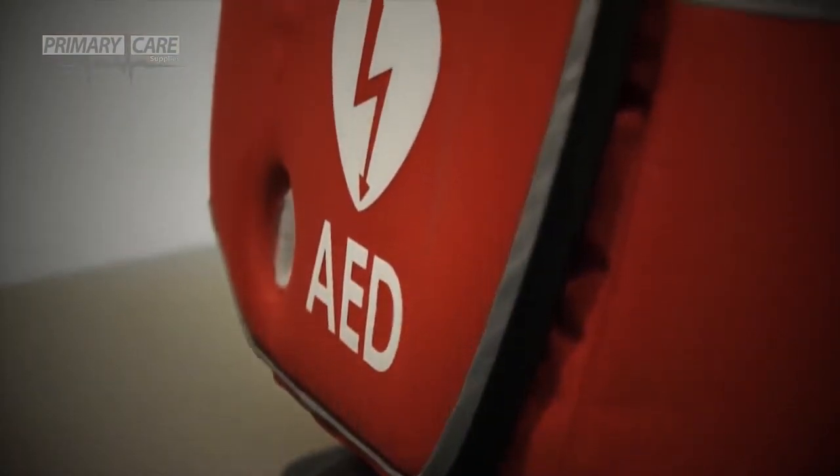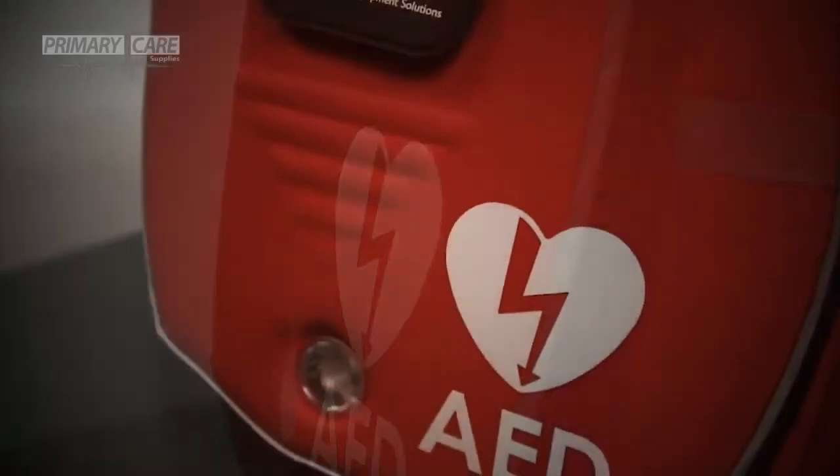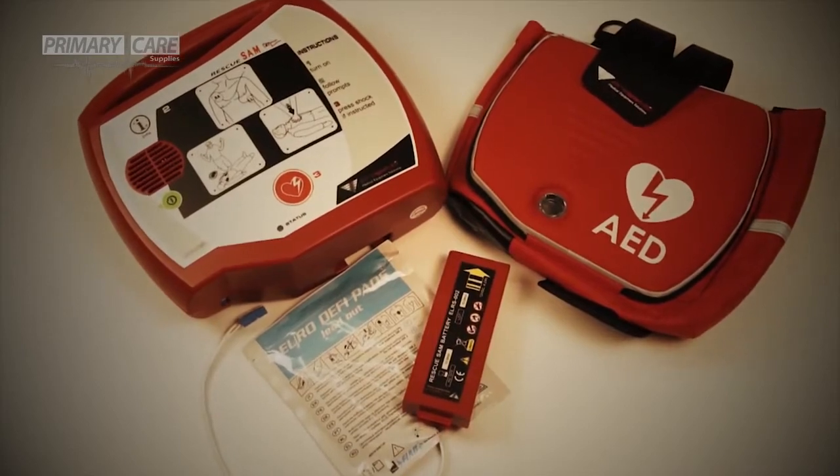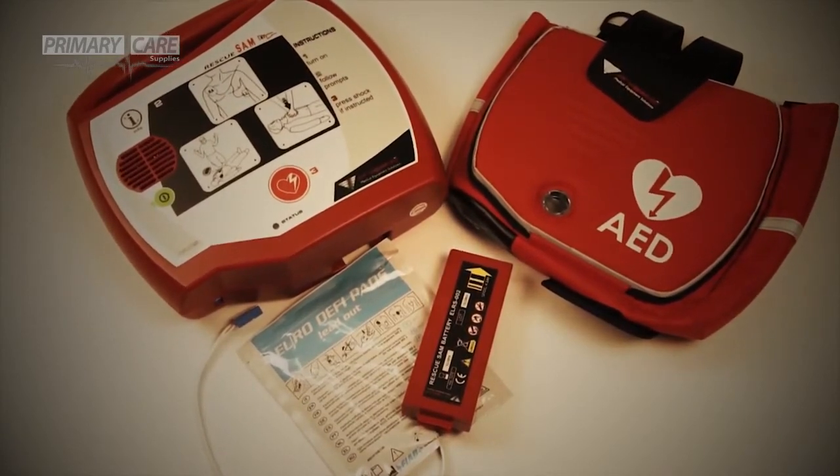Hello and welcome to this short video demonstration on the Rescue Sam Semi-Automatic Defibrillator. The Rescue Sam Defibrillator is really simple to use and comes with a protective bag, long life battery and a set of ready-to-use adult pads as standard.